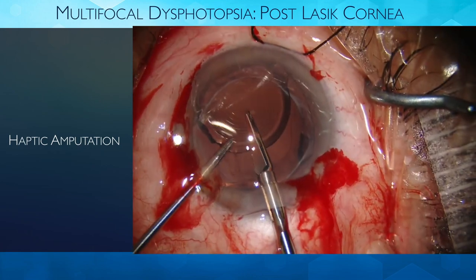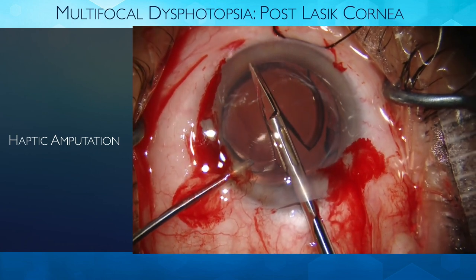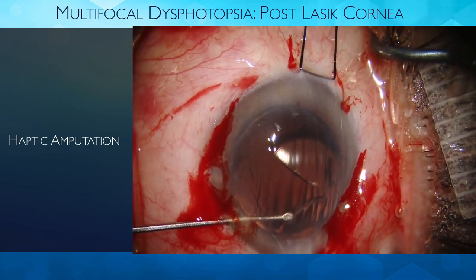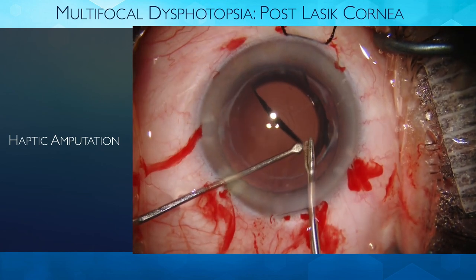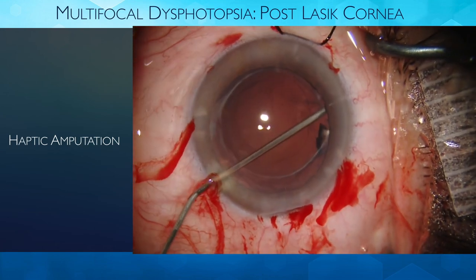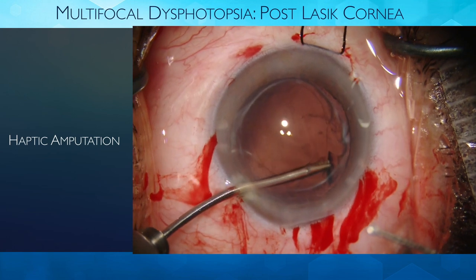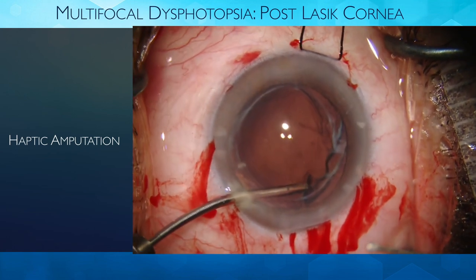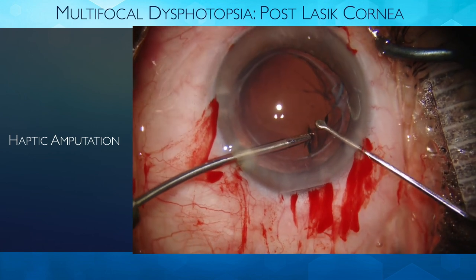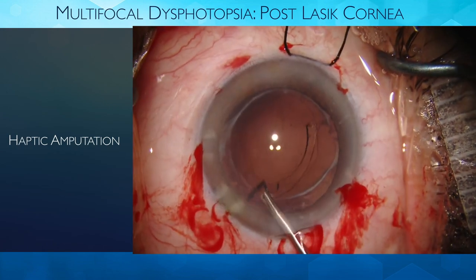We're going to put viscoelastic above and below and then cut with 19-gauge scissors to bisect. We could also make a paracentesis 180 degrees away and fold the lens, but that requires a 3-millimeter incision. We're taking this lens out using a spatula as a guard. Once we get the bulk of the lens out, sometimes the haptic in the bag comes out freely. We use a spatula for counter-traction to protect the zonule, and continue visco-dissecting down that tunnel. With counter-traction, we're able to get the haptic out nicely.